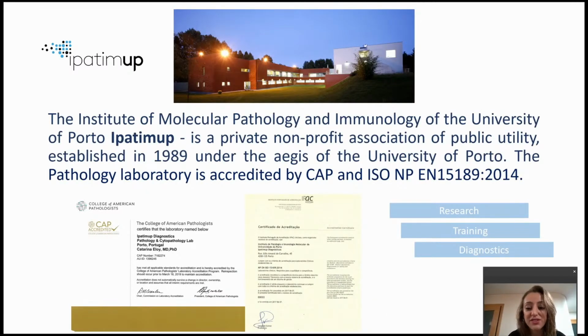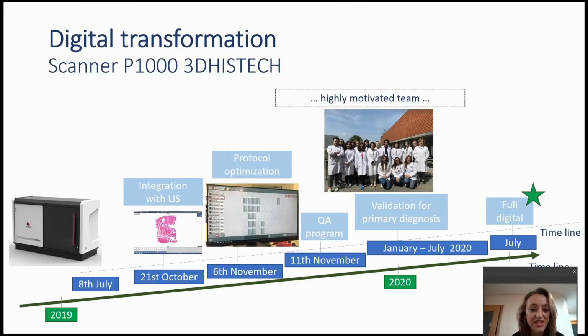Our institute has been founded for more than 30 years in Porto, Portugal. It is a research institute, but it has a pathology lab that is double accredited by the College of American Pathologists and ISO, so there are strict rules for diagnosis. And these rules helped us a lot to implement digital pathology.